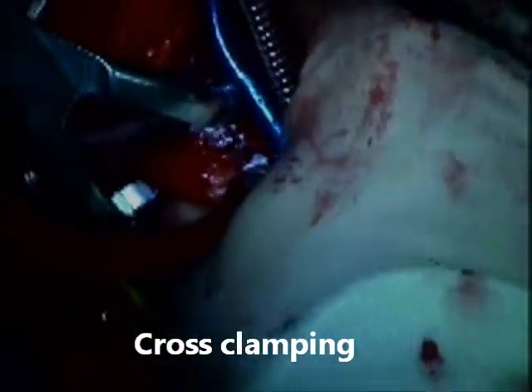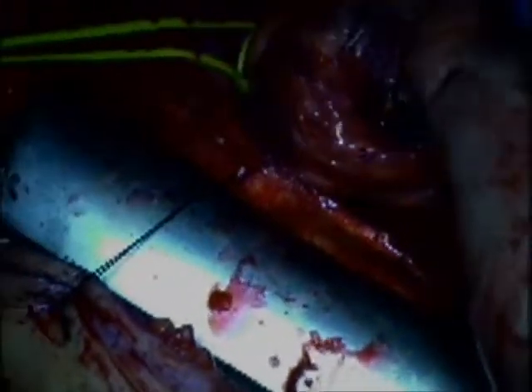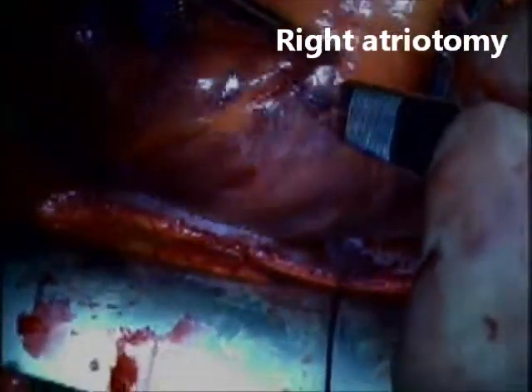Here I am cross-clamping the ascending aorta, and at this point I inject my retrograde cardioplegia. I tighten my snares and proceed with a right atriotomy.